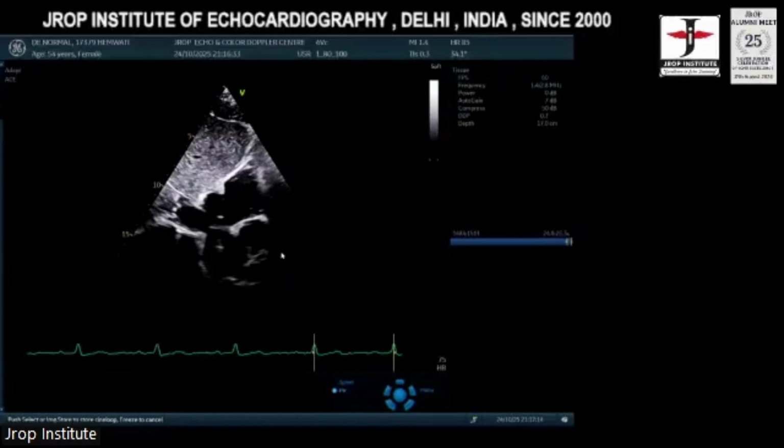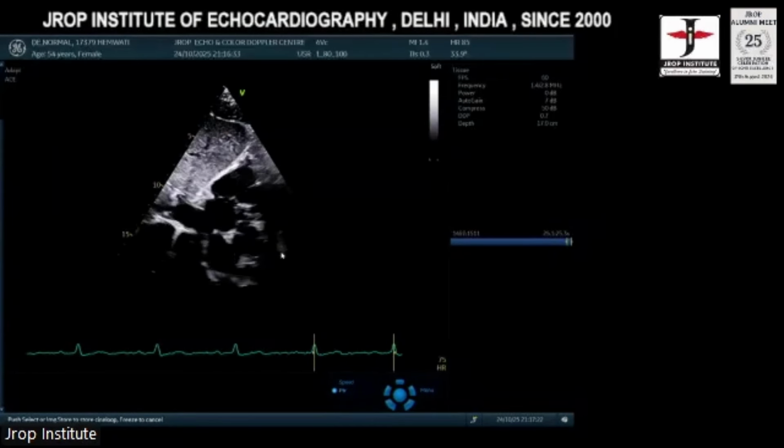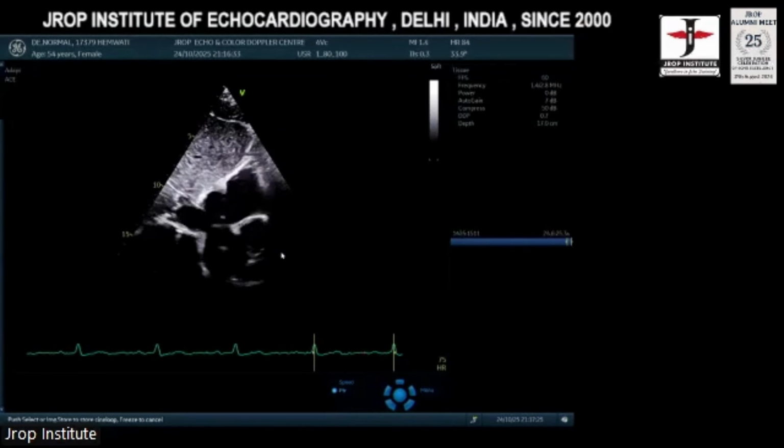Dr. Kamal Malviya, 21. Yes, sir. Sir, can you please repeat how to set up the Nyquist limit, and why do we set this Nyquist limit? What is the significance of it? The significance of this Nyquist limit is, I'll just show you what the Nyquist limit is.